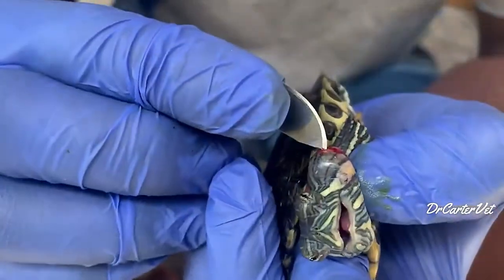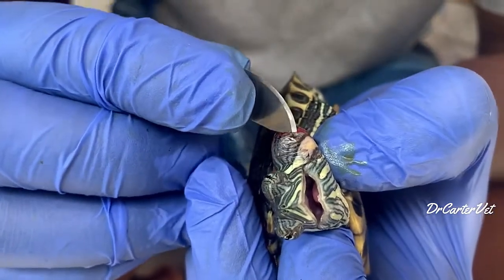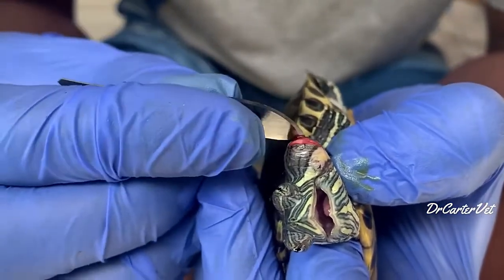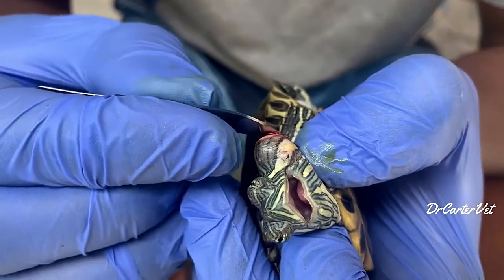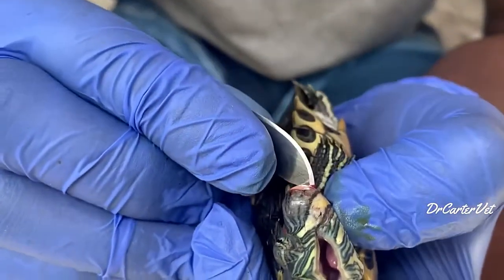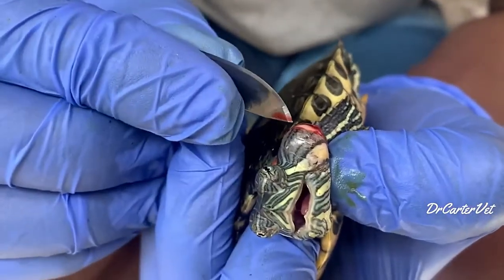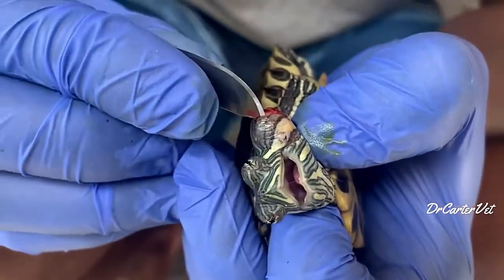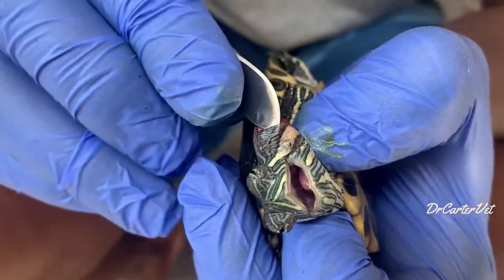If you're a veterinarian, you may consider some form of anesthesia or a sedative. In this case, I used a local block with local anesthetic. Being such a small reptile with an external lesion, I did not see the need for full general anesthesia.